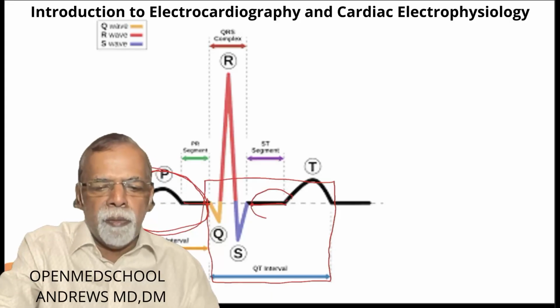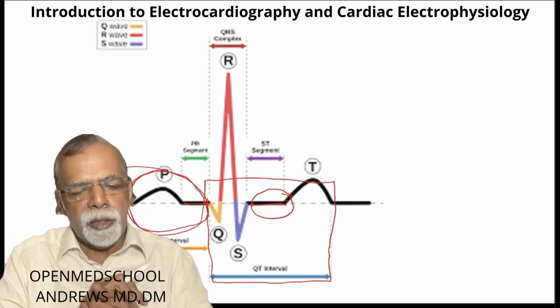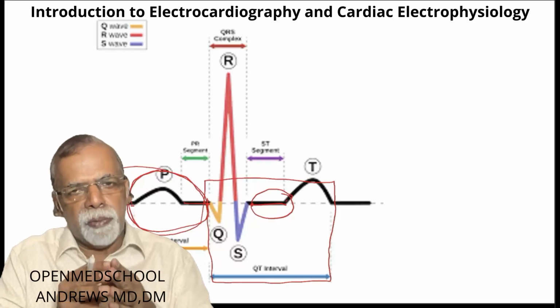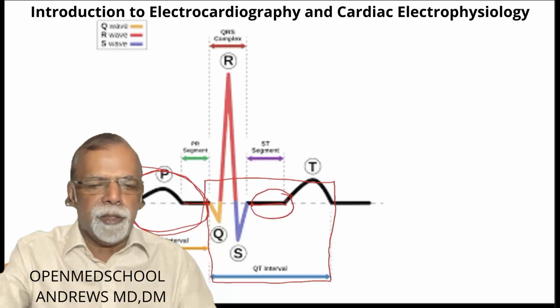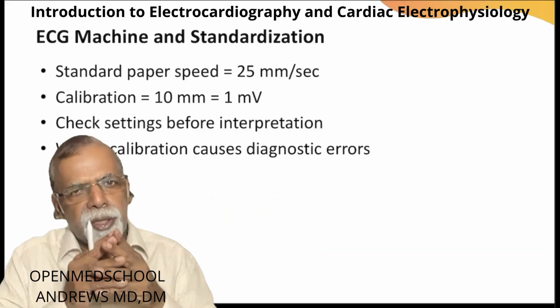It is very important because for changes of myocardial infarction, ischemia, etc., we are looking at the ST segment. So all of you take a piece of paper, draw this ECG and learn it. Then we will go to the ECG machine.